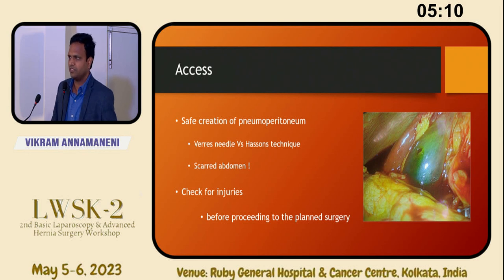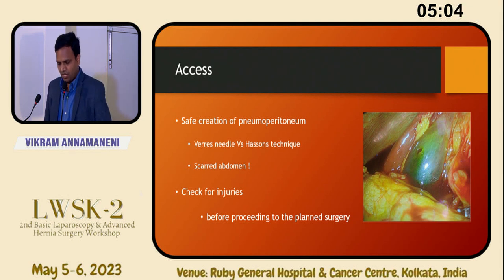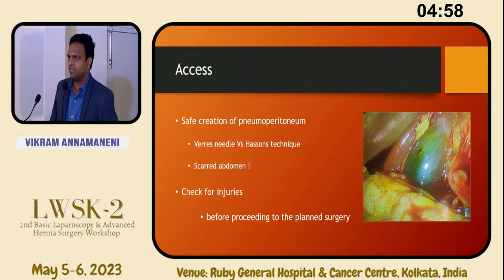So many safe points are there for entry. But we should create a safe pneumoperitoneum. And after putting the pneumoperitoneum, directly, don't go to the gallbladder and put the other ports. Try to look for injuries. Look for injuries wherever you are entering.